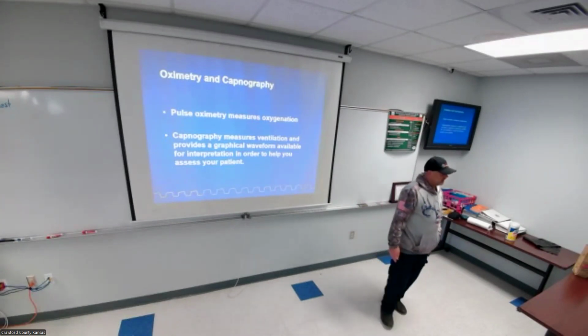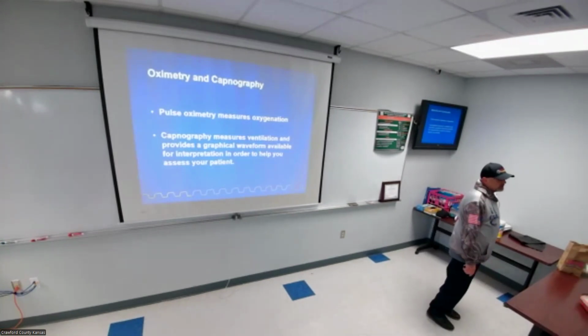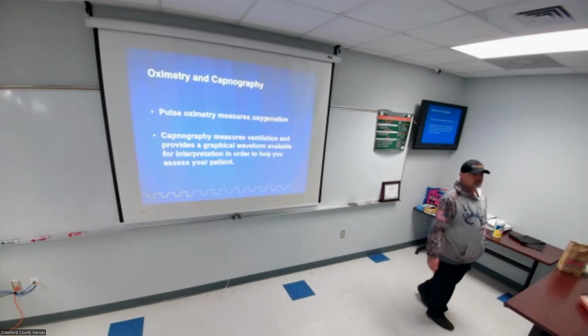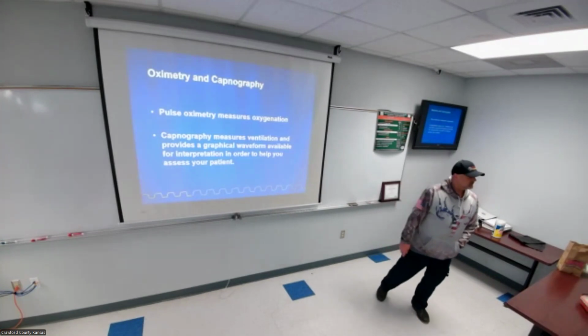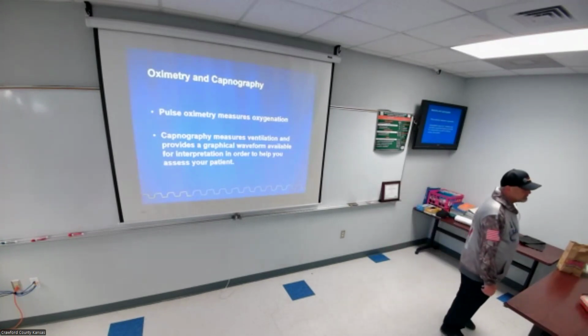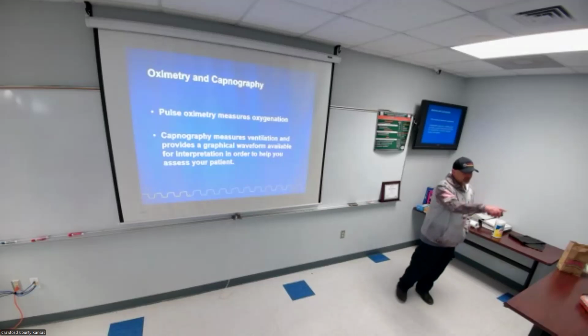So what are we looking at when we have somebody that we throw them on there, they have difficulty breathing, and their end tidal is like 70? What are we thinking could be this patient's past medical history, or what's going on with this one? Might give you an idea. Hyperventilation? You sure? Hypoventilation.